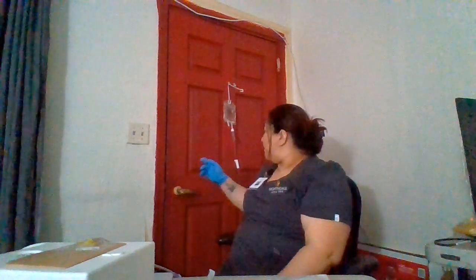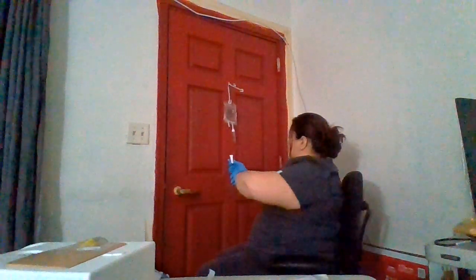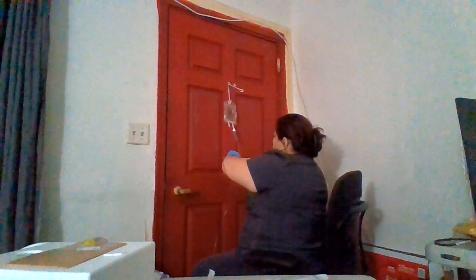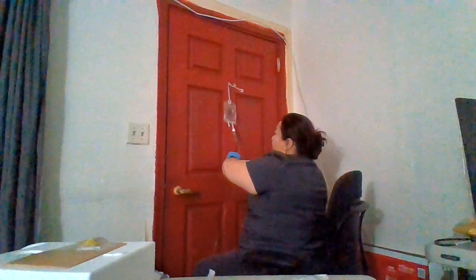So now my next step is going to be making sure that the 38 drops per minute fluid is going to be started. So I'm going to be calculating the drip chamber here, and I will be counting for a whole minute. We always start off slow, and we will be counting the drops in the drip chamber.